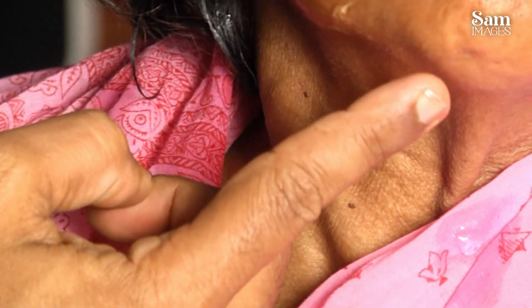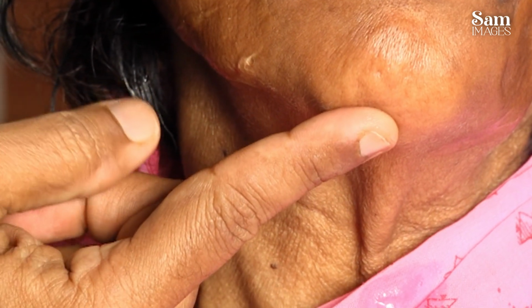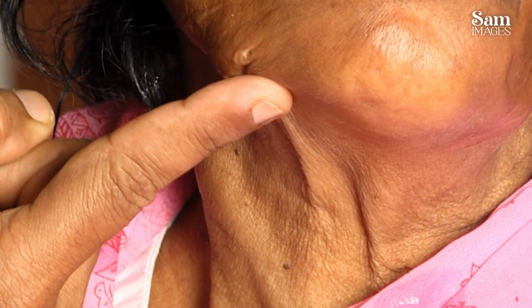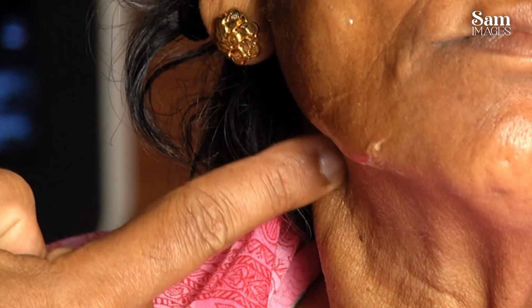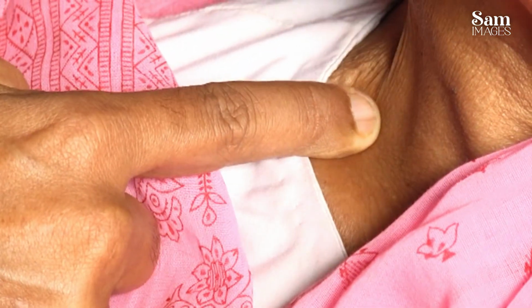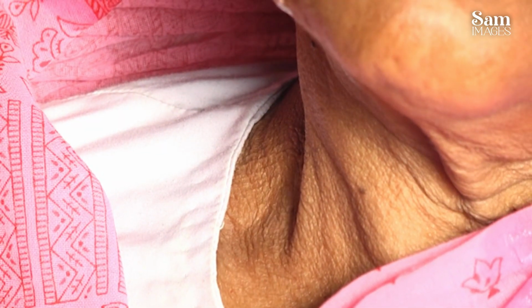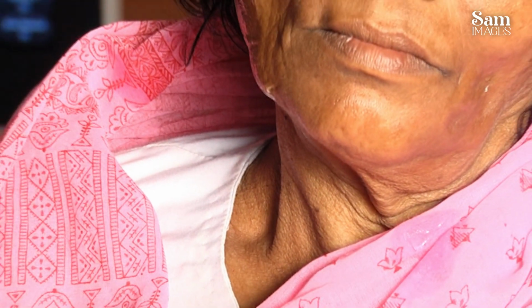So this way, when I look for the cervical lymph nodes, I'll start from the symphysis menti and then come in this fashion, come here, and then go like this, and then go here, and then supraclavicular, then posterior triangle, so that I will not miss any of the lymph nodes. Like a Z, it is like this, and then come here, down, and then go up to the posterior triangle. When I look at it like that, I will not miss. So identification, wherever it is there, you just make a note of it. That's all. That will show you where the lymph node is.